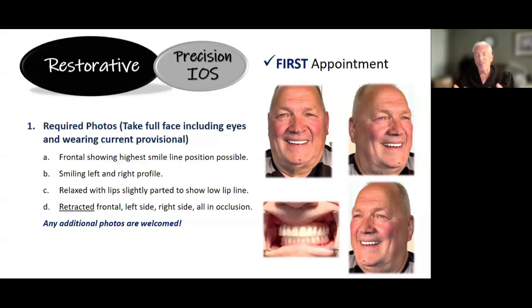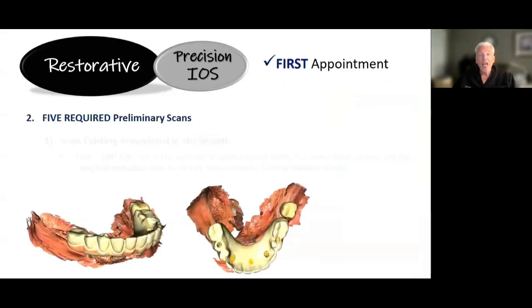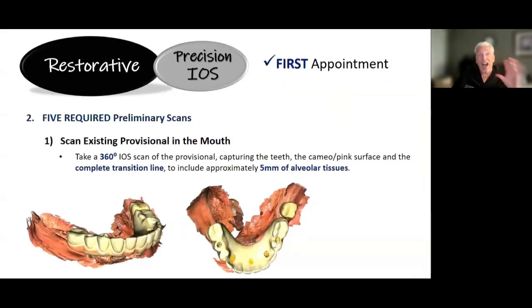And smile designs, we have so many options with smile designs and shapes of teeth, etc. We don't get to see the patient, so this helps us a lot. So we really welcome these photos. And today, your iPhone's perfectly fine for doing that. Snap some of those photos, easy to shoot those to us. All right, there's 5 required scans on the day of your first restorative appointment.